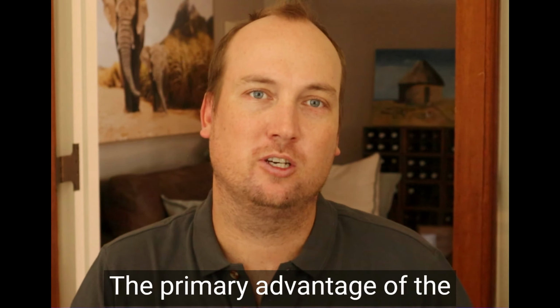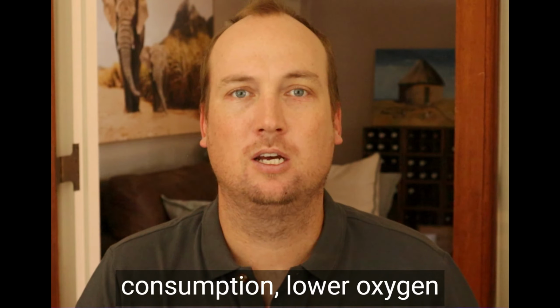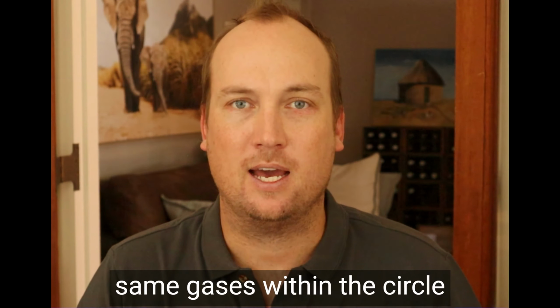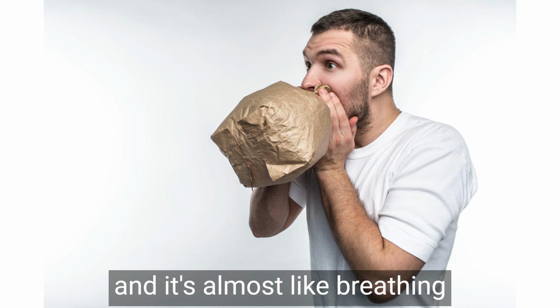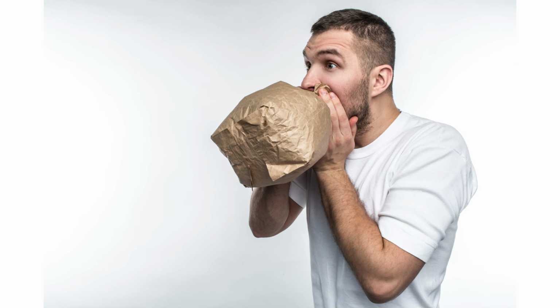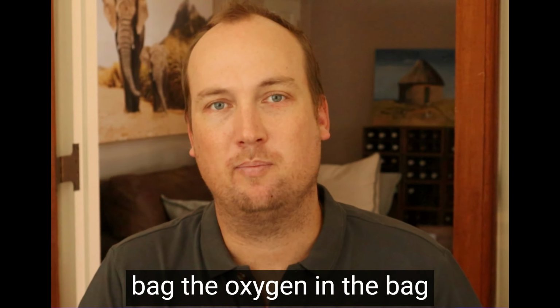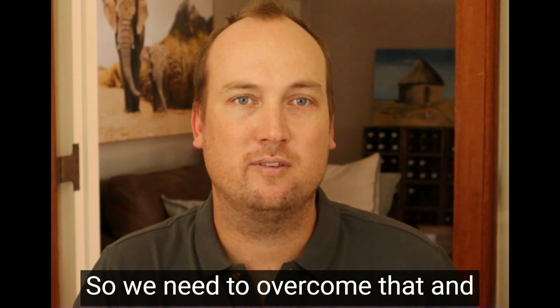The primary advantage of the circle system is lower gas usage. That's lower volatile consumption, lower oxygen usage, and lower air usage. And this is achieved by the patient rebreathing the same gases within the circle system over and over again. It's almost like breathing air in and out of a brown paper bag, like in this picture. The problem is, though, that as the person in this picture rebreathes the same air from the paper bag, the oxygen in the bag decreases and the carbon dioxide in the bag increases. So we need to overcome that.